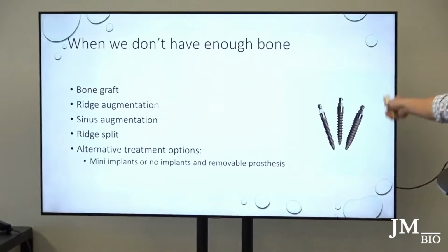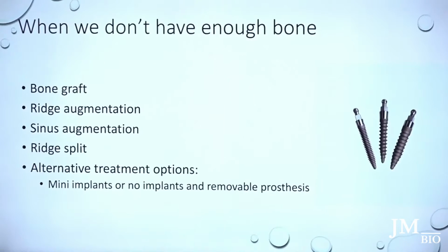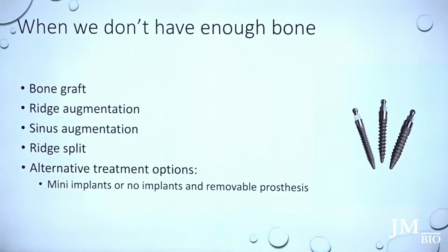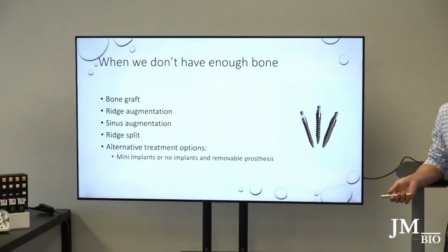And they even have mini implants these days, right? I talked a little bit about mini implants, and there are cases where they are very useful. I talked about my grandfather earlier; it was a short time frame, and one of the benefits is I can immediately load, and he goes home. If something fails, we can take one out and put another one next door. It's not a big deal. Unfortunately, nothing has failed on him. People say, oh, I don't want to do minis, but I think there's a place and a time for it.